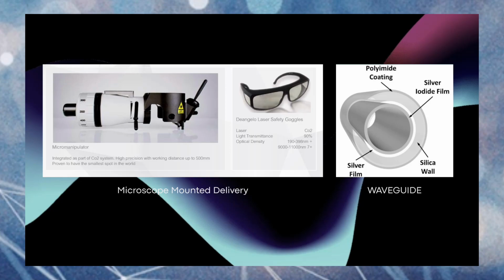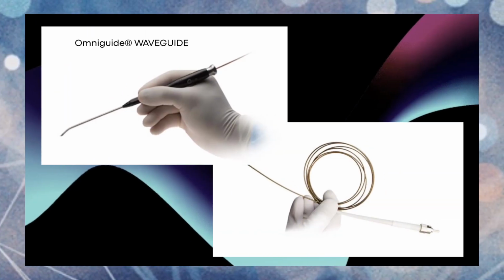Now, the handheld waveguides do exist for CO2, and they are basically a silica tube with a coating, with a silver coating. It's very similar to the technology that's used in the stealth fighter jets. So it basically bounces off the coating. One of the first ones, and I did research with this company, was the OmniGuide system. And the OmniGuide system was one of the earliest waveguides. There are others out today.